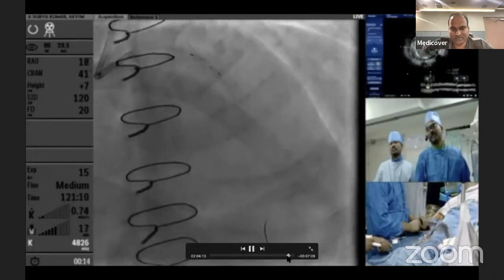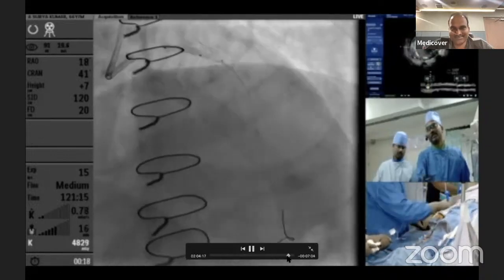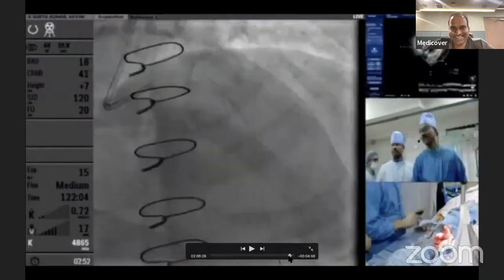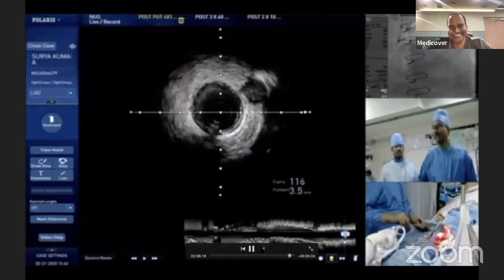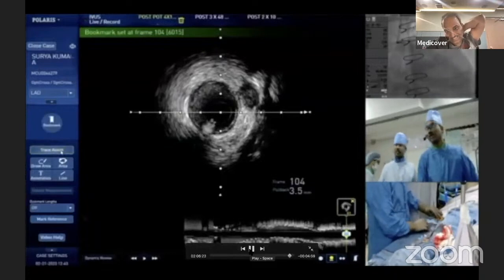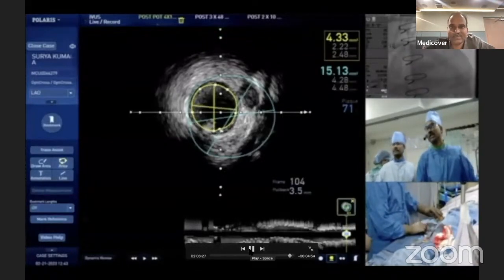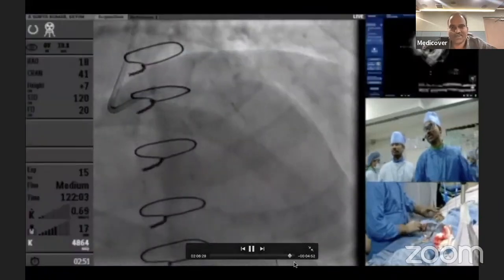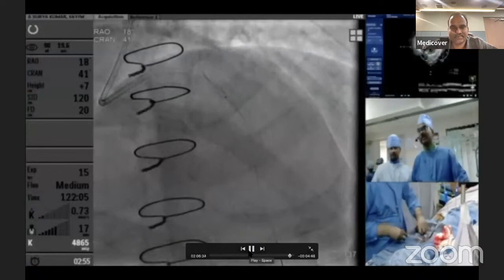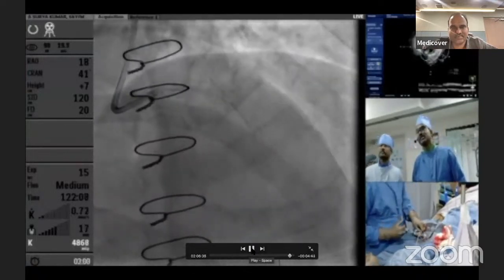Sometimes CTO also should have two teams. Like sometimes in very complex calcified lesions, you need two teams, one to do the post dilatation and one to do up to the post dilatation, because you are tired. Sometimes you're really tired by that. I think now we'll show the final result. One side is pressed, the other side is free. Only then can you re-engage your guide in the next procedure.